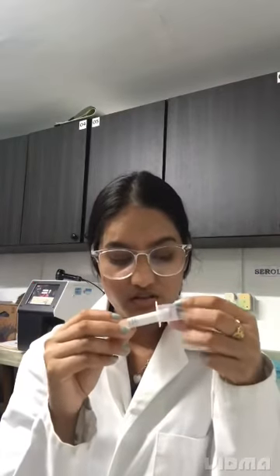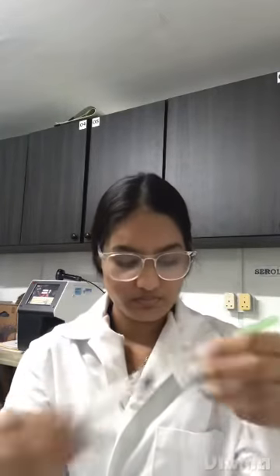This here is the cap or the safety device of the needle. As you remove this, you insert the needle into the vein. You then engage the tube into the holder. Once penetrated by the needle, the tube will automatically fill with the correct amount of blood.